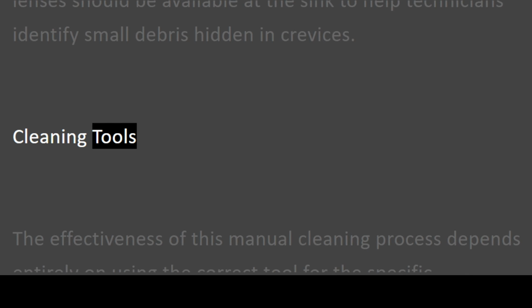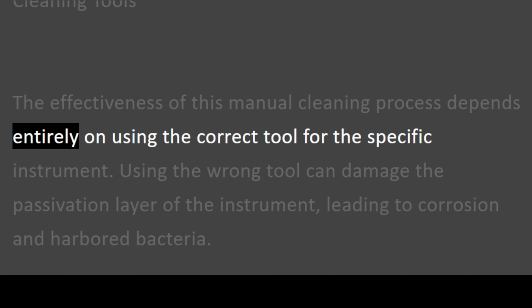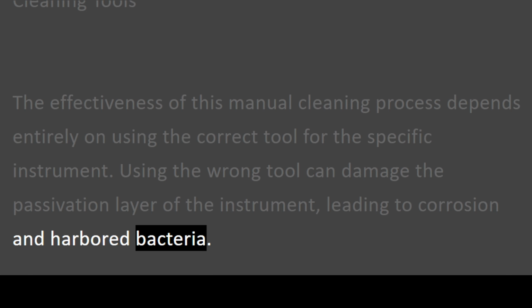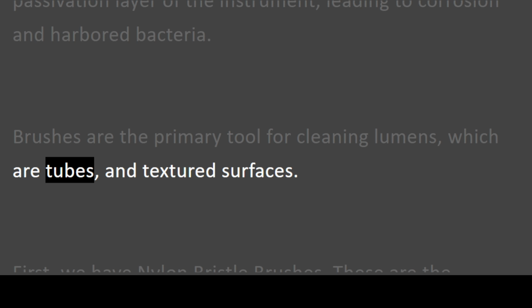Cleaning tools. The effectiveness of this manual cleaning process depends entirely on using the correct tool for the specific instrument. Using the wrong tool can damage the passivation layer of the instrument, leading to corrosion and harbored bacteria.